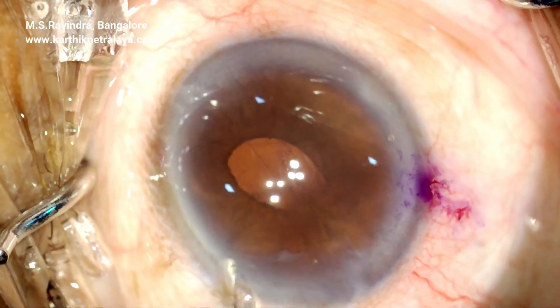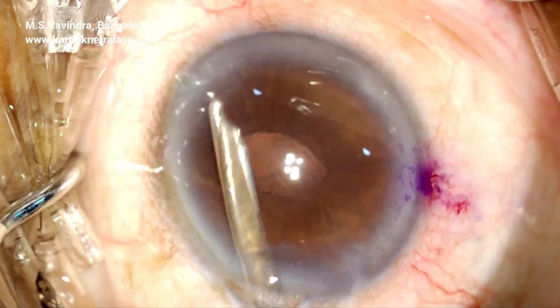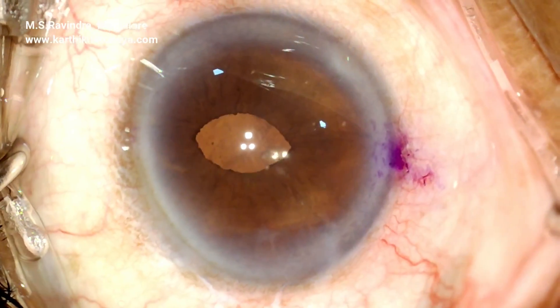Fortunately there is no vitreous disturbance and that's the end of surgery. It's a very quick and least traumatic surgery, and the vitreous face is also kept intact in this particular case.